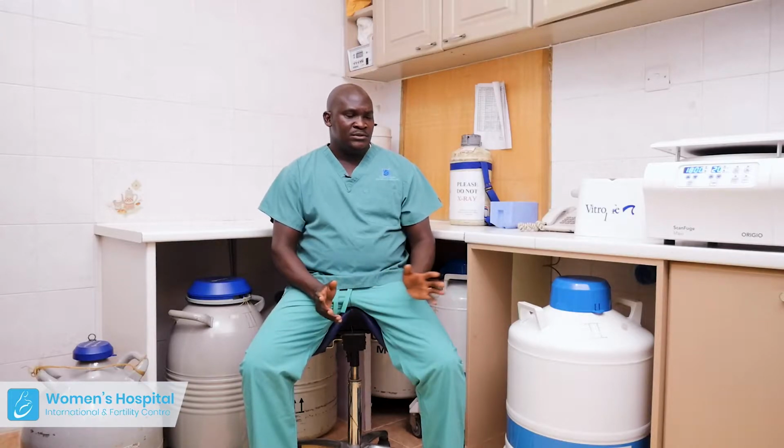Today I'm going to talk about gamete storage or gamete freezing. By gametes, we are referring to either the egg for the female or the sperm for the male. And where we are seated right now is where we basically store those gametes. I'll discuss in a little bit of detail the male gamete storage and the female gamete storage separately, but I will start with the male gamete storage.